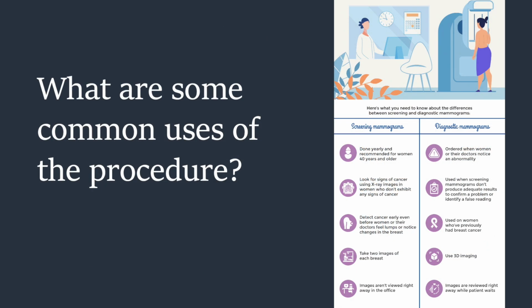What are some common uses of mammography? Well, we have screening mammography and diagnostic mammography. Screening mammography plays a central part in early detection of breast cancers because it can show change in the breast years before a patient or physician can feel them. Screening mammography is recommended every year for women, beginning at age 40.